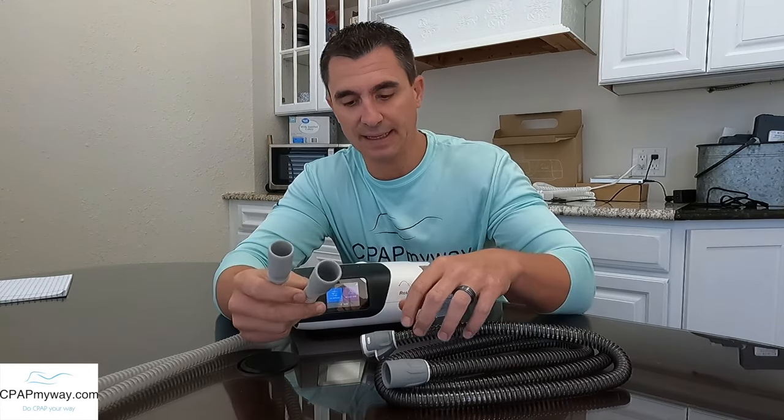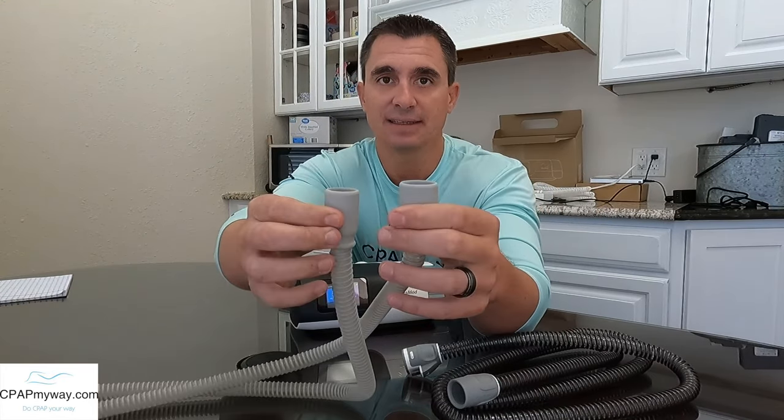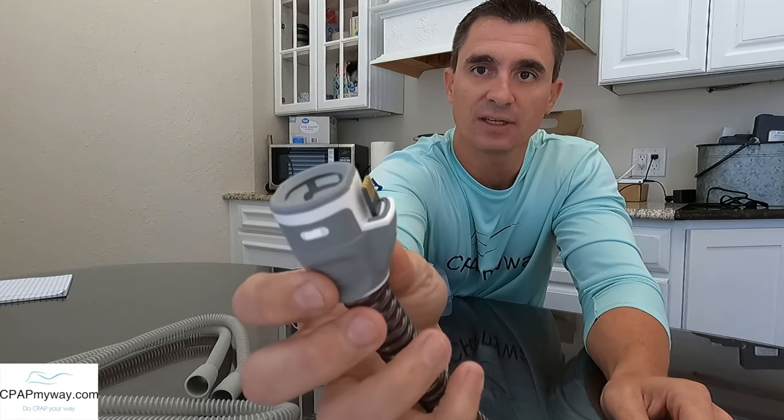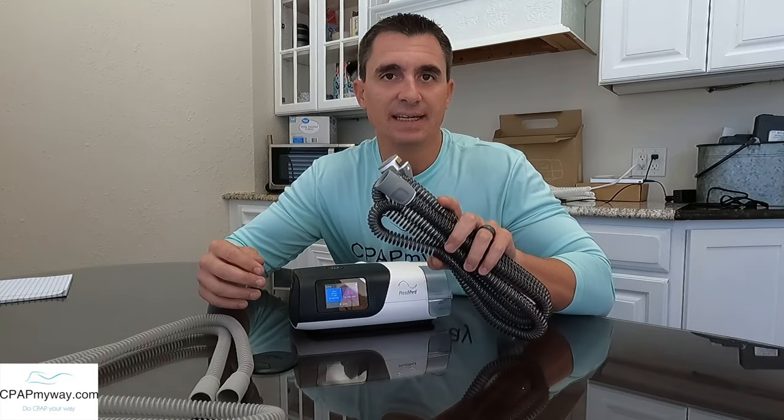The difference between a heated tube like this one for the AirSense 11 and a standard tube like the slimline tube is that the standard tubing always has identical ends — soft rubbery ends on each end. Obviously, the standard tube doesn't have heated coils. On the heated tube, you'll notice it almost always has some sort of electrode right there. Some of them even have an independent little plug that comes off the end, but this particular one for the AirSense 11 has a little electrode, and then the other end is just that soft rubber that allows you to attach to the mask. So why would you need a heated tube?